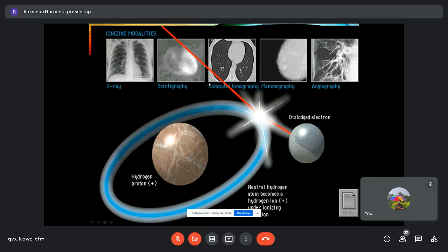Okay, that's the main difference. And then the gamma camera, mainly the gantry, tries to capture all these dots of radiation from the patient, because the patient has been injected. Okay. So what is this? This is not Earth and orbits, but rather it shows you the different types of atoms that are present in our body.